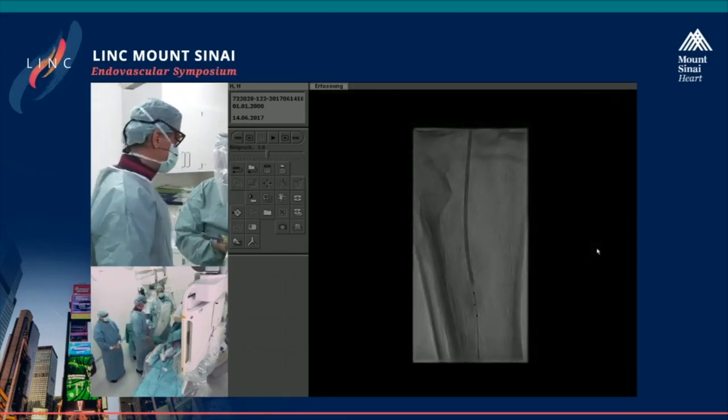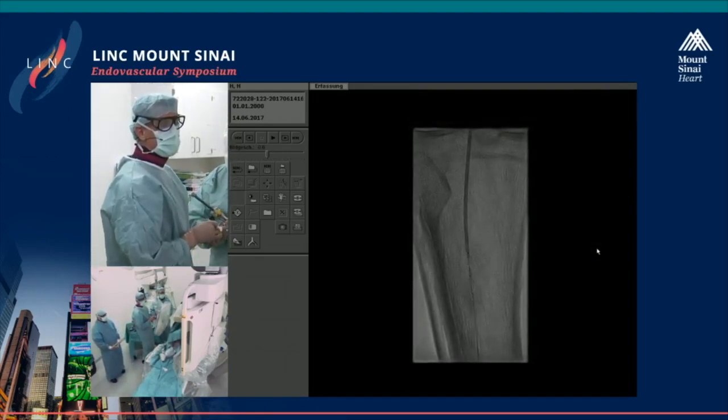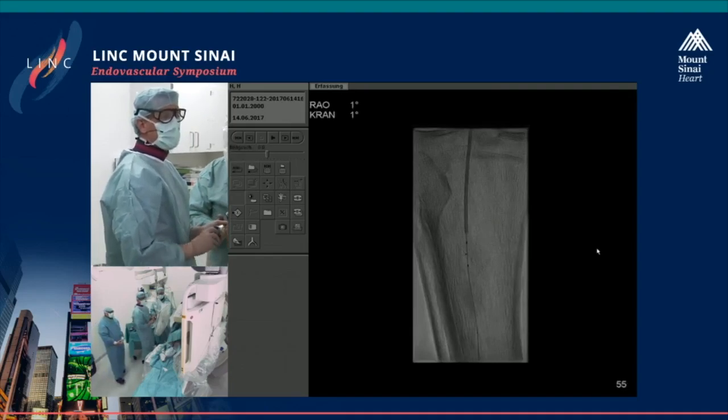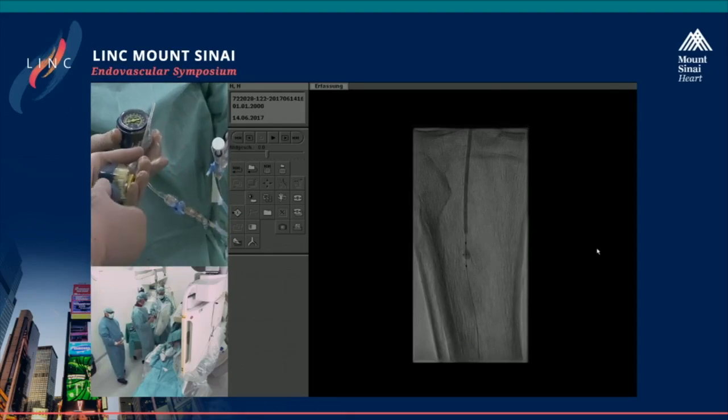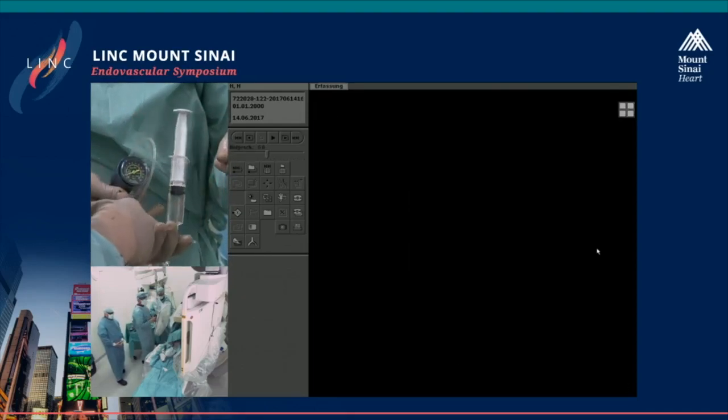How about compression of the lumen from that little bubble of fluid you put around? Ever seen anything like that? I haven't seen any compression of the lumen. You know, such a small needle. I mean, you're talking about the blood flow that goes into the adventitia, or the dexamethasone and dye that go into the adventitia. I've never had any compression.